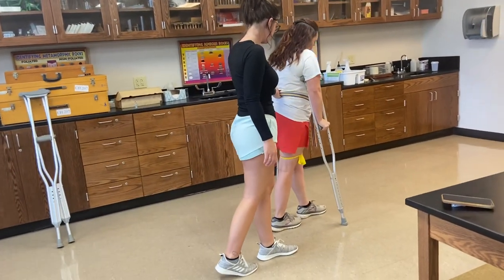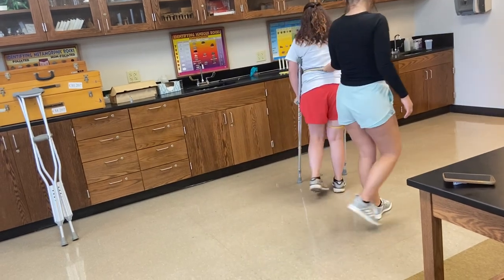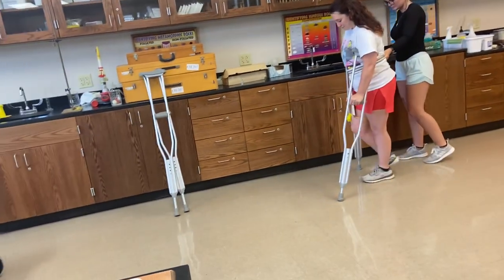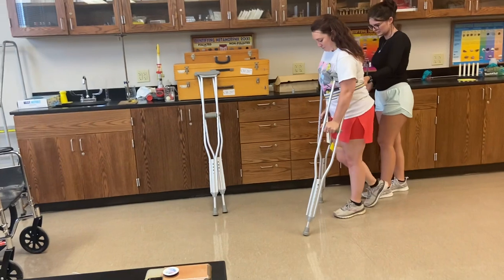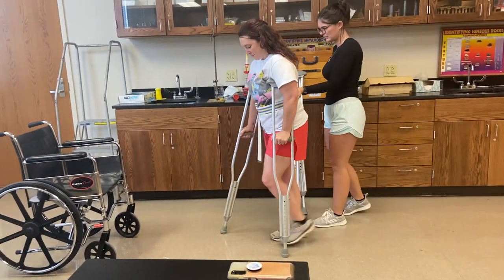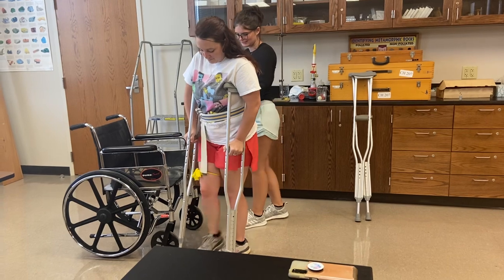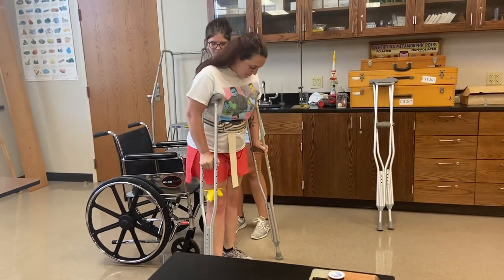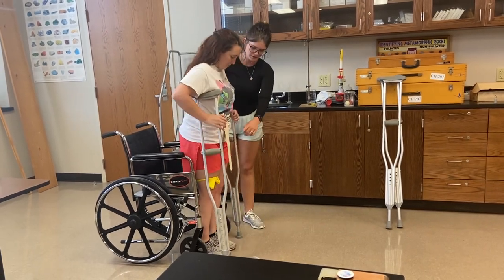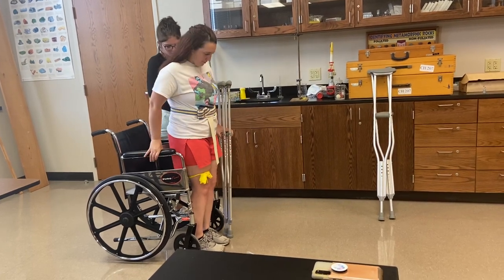Now you'll start turning towards your good side, which is your left side. Then I'll have you turn again — turn to your good side. Once you feel the wheelchair in the back, you'll put this one over here, reach back with the other hand to the wheelchair arm and sit down.